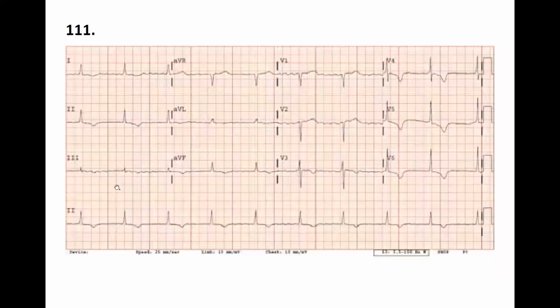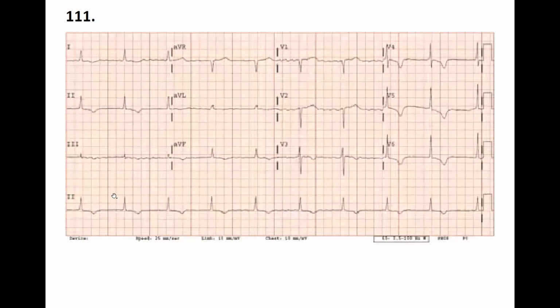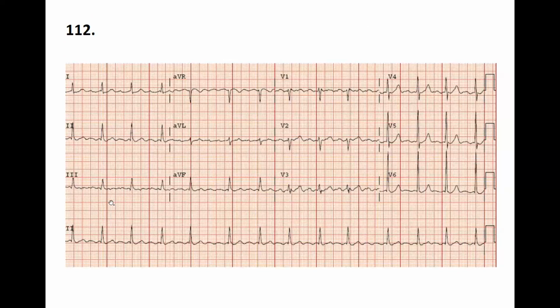Okay, 111. Nope. 112. Hello, Professor. Yes. Okay, so I looked at the ECG and it was rhythmic.